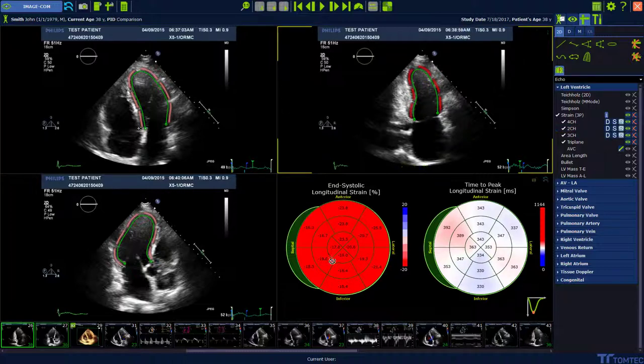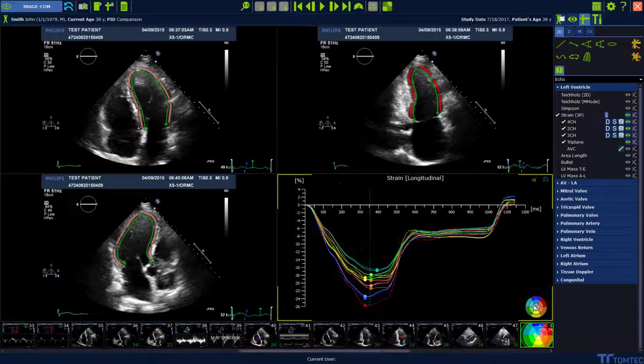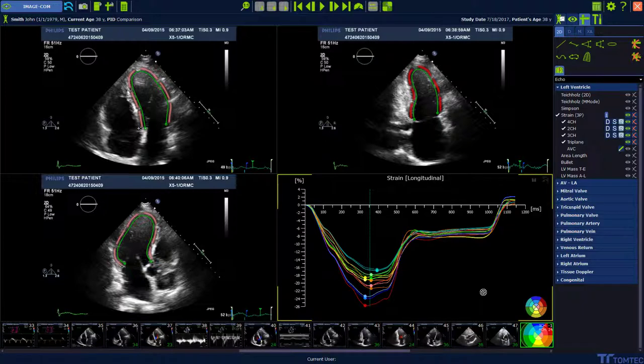The bull's eye view will be displayed directly after the analysis. Select the segmental analysis button to visualize the longitudinal strain curves based on 16 segments.